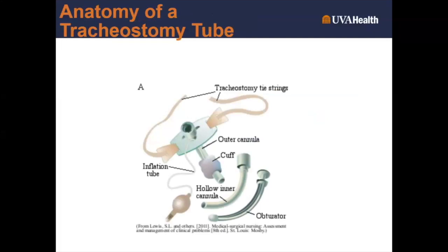So I like to talk about the anatomy of a tracheostomy tube. This one is a cuffed tube, and we'll talk about the differences between a cuffed tracheostomy tube and an uncuffed tracheostomy tube momentarily, but I do want to hit all of the pieces here. First, let's start out with the flange. So the flange is that metal piece you see on your, or that long plastic piece on your screen there. Though trachs may be of varying materials, they may be plastic, silicone, polyurethane, or even metal.